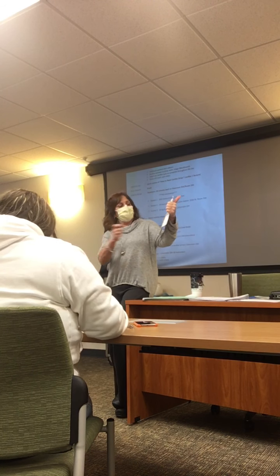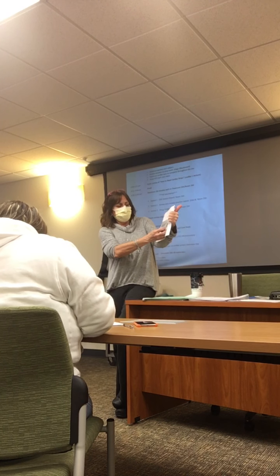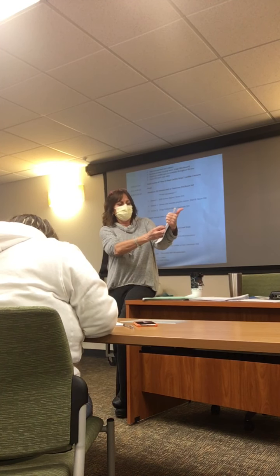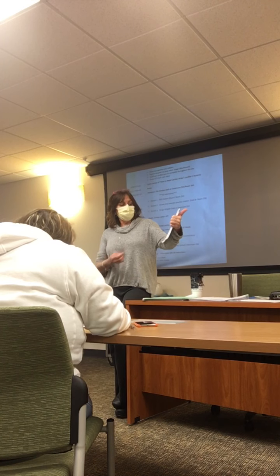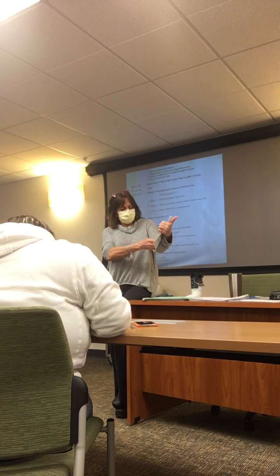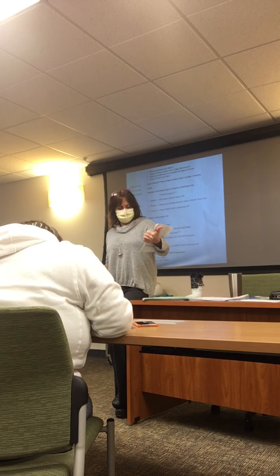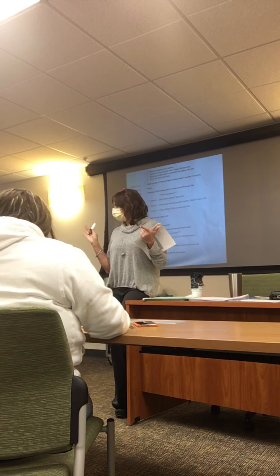So I'm going to take my calipers and I'm going to measure R to R and kind of plot it out to see if my ventricular rate is regular. Are you getting a regular rate here? Yeah. So I have a regular ventricular rate. How about an atrial rate? How would I measure that? How would I plot that out? P wave to P wave. Does it look like it's regular? Yep. Good. So is everybody okay with that so far?